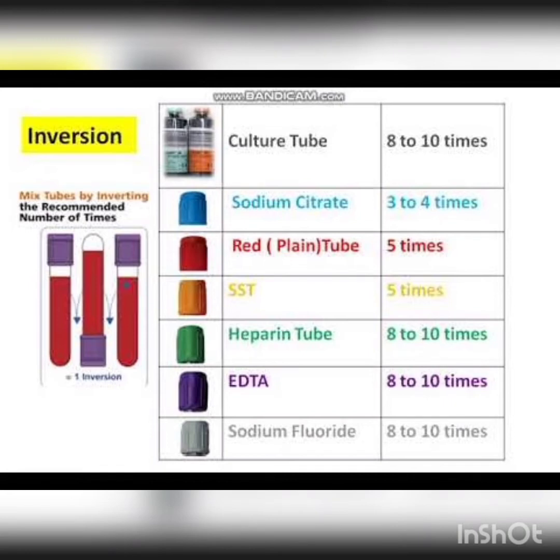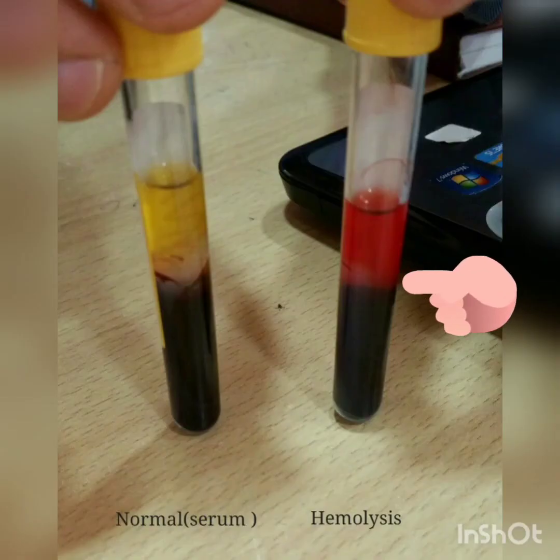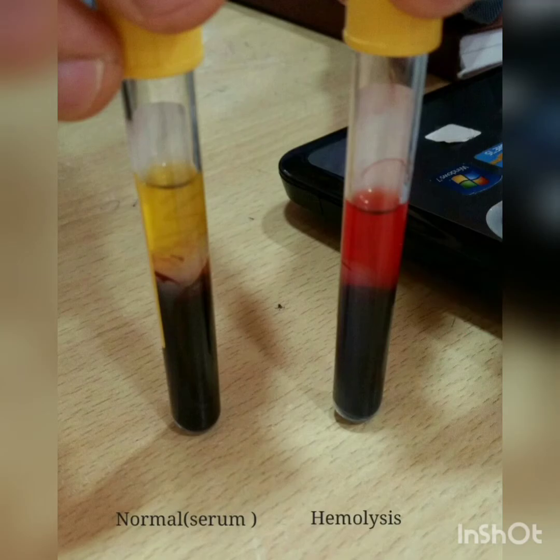For sodium citrate 3 to 4 times, and if you collect the sample in a red plain tube, it should be mixed 5 times. SST 5 times, heparin tube 8 to 10 times, EDTA 8 to 10 times, sodium fluoride also 8 to 10 times, in inversion position. And friends, you should not shake the sample very rigorously, because sometimes the RBCs may get hemolyzed. So slowly you have to mix the sample.